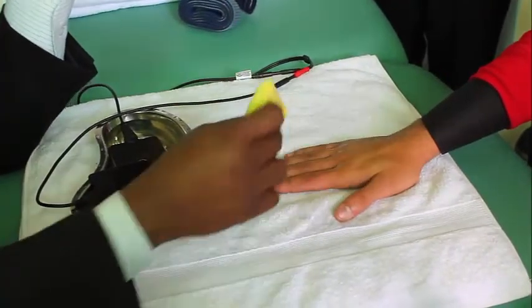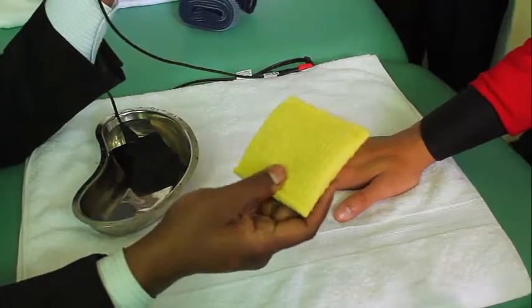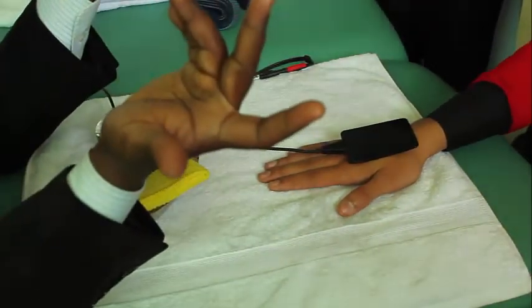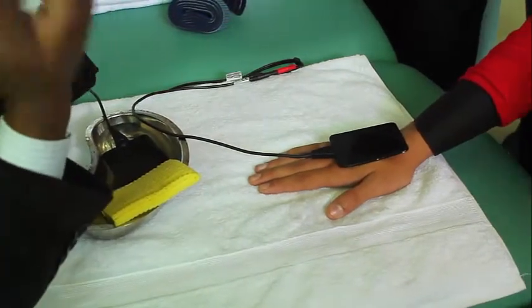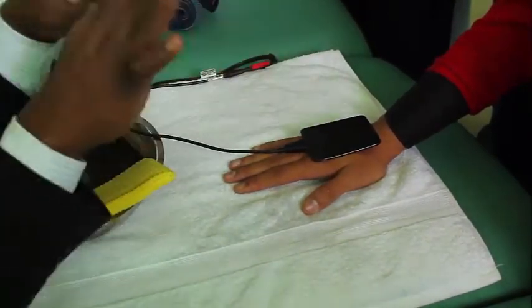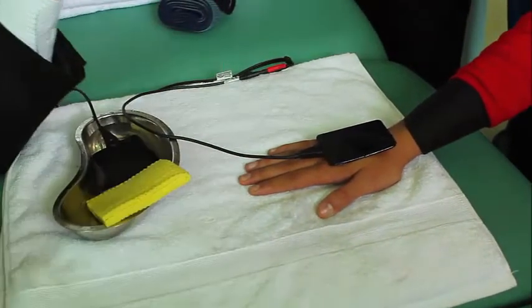Even the electrode which you are stimulating, I am going to keep it. If I keep it like this directly, after some time what happens? The water will dry. My treatment is 20 minutes or 30 minutes. So for 20 to 30 minutes, I want water to be there at that particular area. Because with more water, it is easy for the current to go inside.